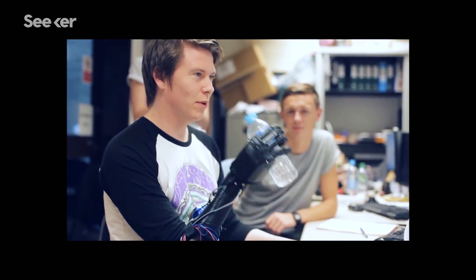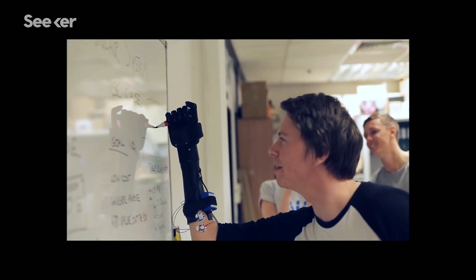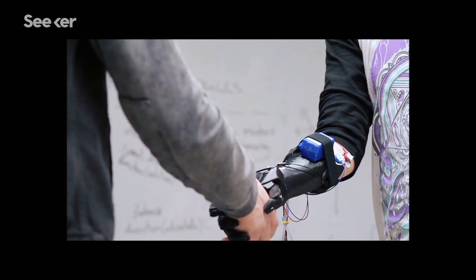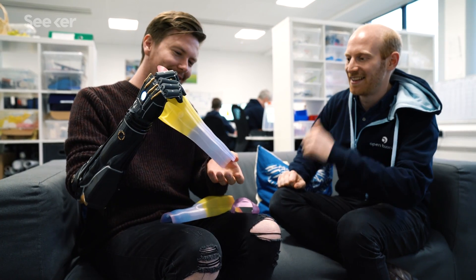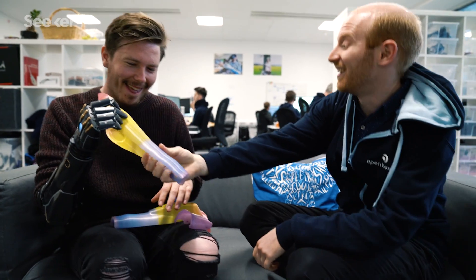We've been continually testing with people from the very beginning, getting feedback on things like how long they can wear it, whether they experience any discomfort, and how we can design the socket and liner to feel really comfortable on their skin.